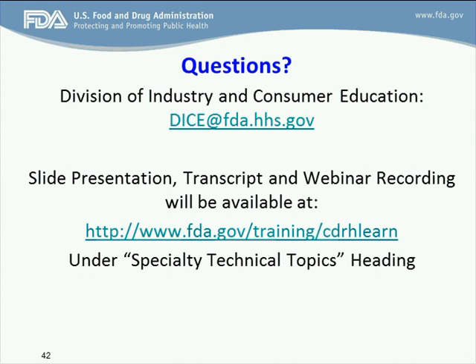Thank you for taking our questions and for the presentation. I had a question on Criteria 6, that the instructions should be understandable. One of the recommendations is that we, as manufacturers, include charts, diagrams, or pictures that can be posted in workstations, and we completely agree that having a diagram of some of the more complicated cleaning steps or sterilization processes could be helpful for the end user. My question is, expectation-wise, for something like a chart or a diagram that's going to be removed from the IFU and placed up on a wall, what level of warnings and cautions would FDA want to be on such a chart or a diagram? Would it need all of the cautions and warnings that would be in the entire IFU, or is it sufficient to put a statement that the IFU should be looked at to see all warnings and cautions?